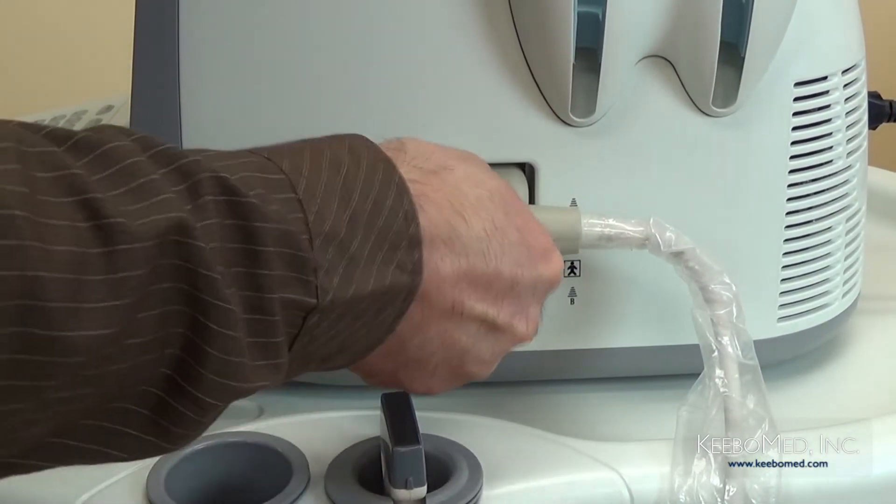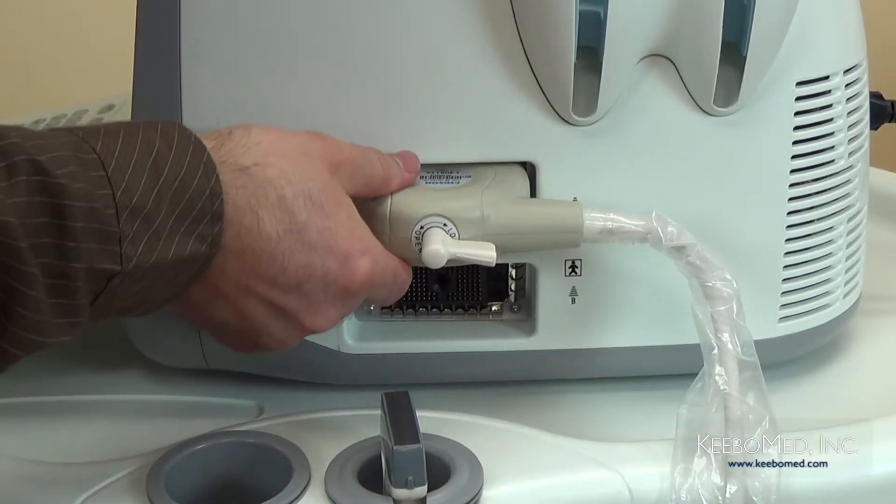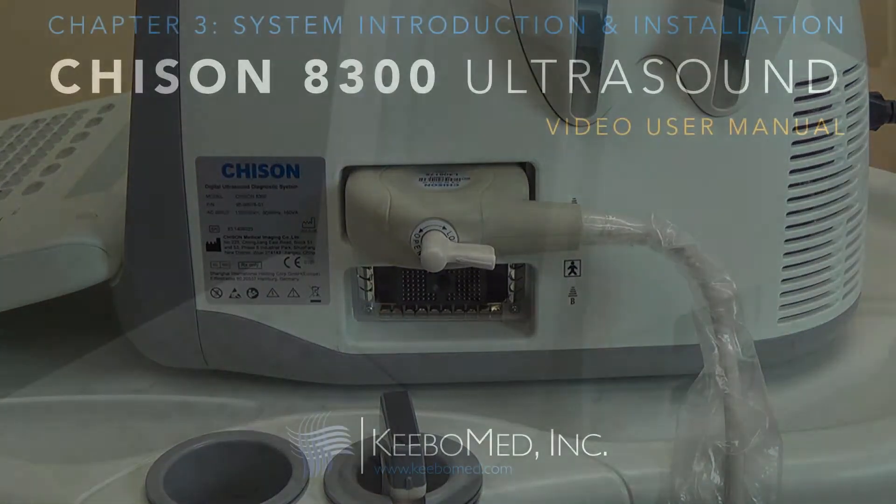Hold the probe connector and turn the lock knob to the locked position. Step 5, check the probe and make sure it is securely connected.